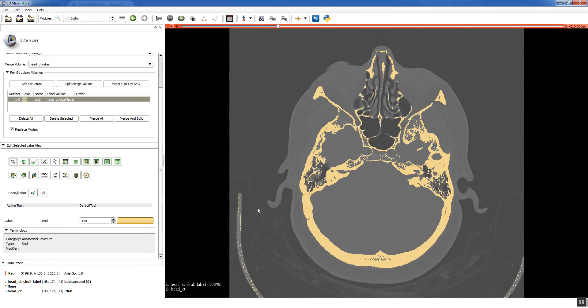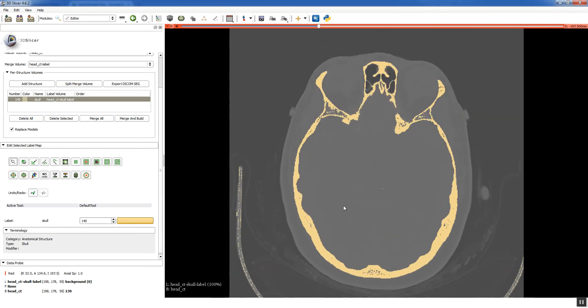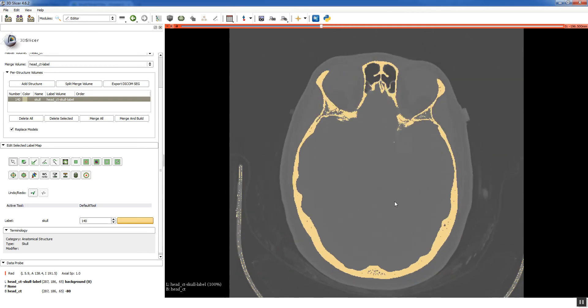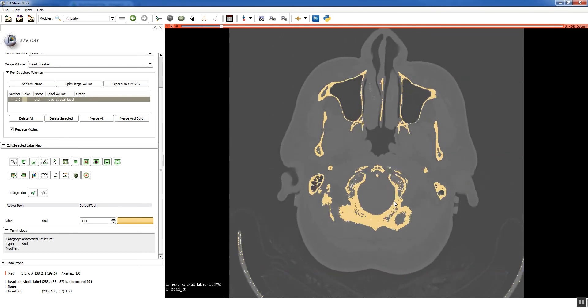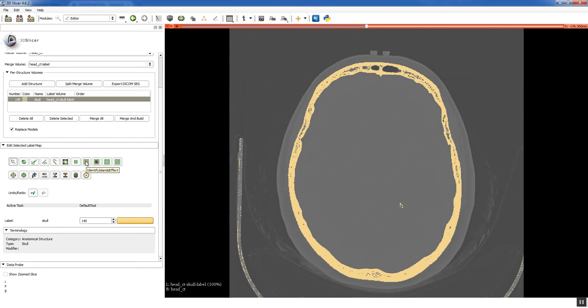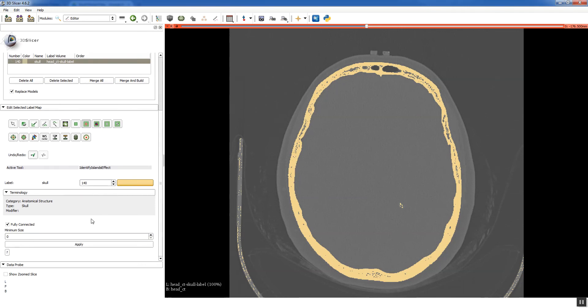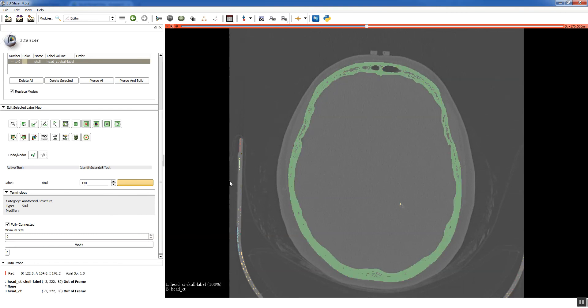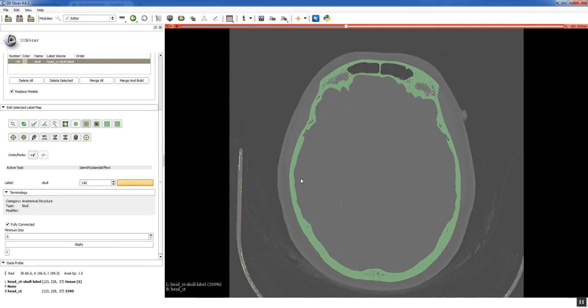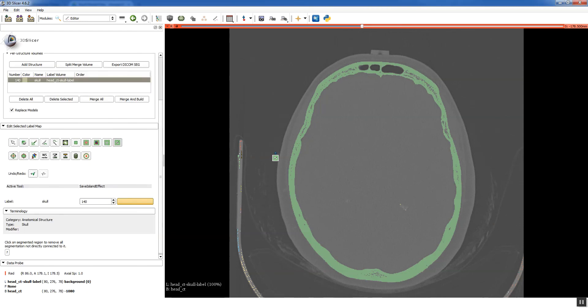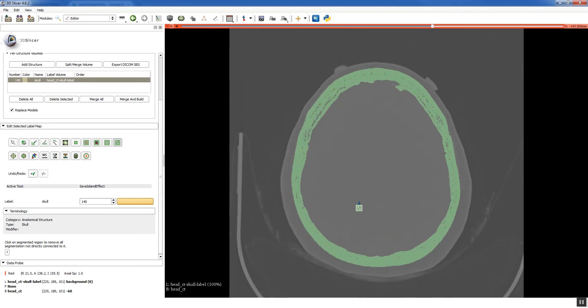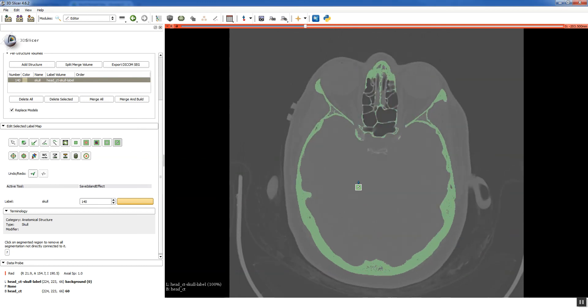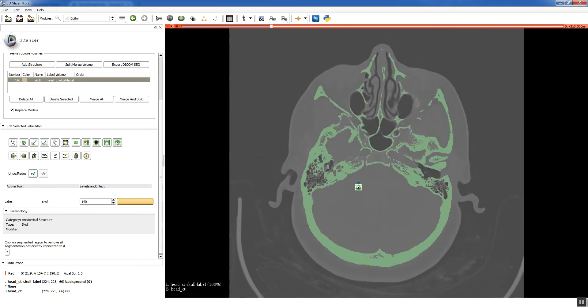So as we scroll through, we'll notice that the skull isn't the only thing that got segmented. There's a head frame here that got segmented. There's a little bit of noise that got included, including some choroid plexus calcifications. So we want to take out things that aren't connected to the bulk of our segmentation. And there's a tool that allows us to do that, and it's called the Identify Islands effect. And it does just that. It identifies different areas that are connected. So you've got to click Apply, and you can see that there are a bunch of different colors. But we know that we're mainly interested in the skull. So we want to keep that island. So the Save Island effect, if you click that button, and then click anywhere in the segmentation that you're interested in, you can see that a lot of other stuff went away. That head frame is no longer segmented. The choroid plexus is no longer segmented.